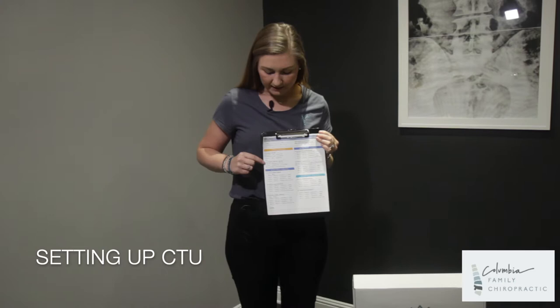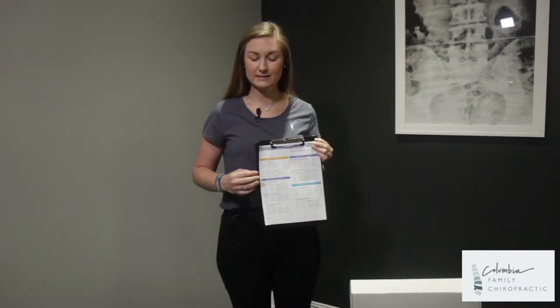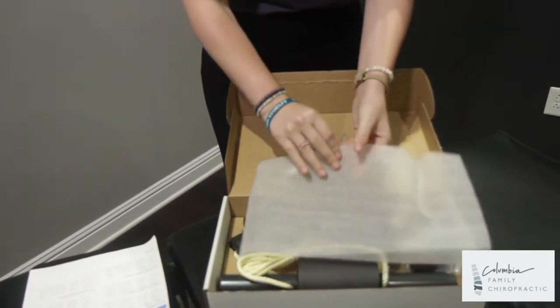Next we will be going over your cervical traction unit. The specific exercise is standing cervical traction. We can use this unit for multiple exercises, so make sure you are looking at your sheet at what the doctor prescribes. I will first show you how we are going to set this up. It will come in this box just like this, and once you open it you will see multiple parts.